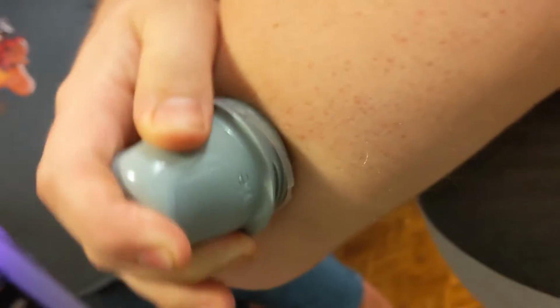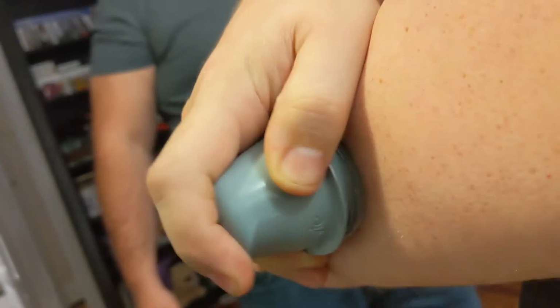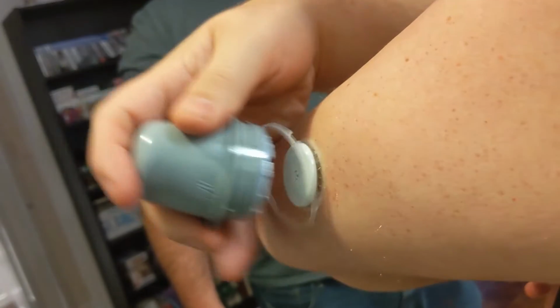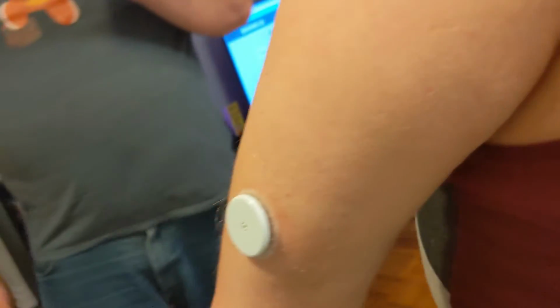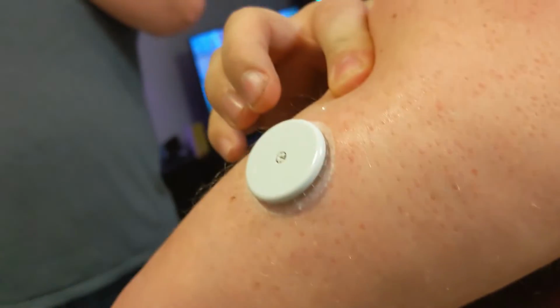Bam! Alexis Mateo. Bam! Now I always do this, push it around a little bit to make sure it sticks in all spots before I take it off. And with any luck, what was that? Something came out. Oh, it just looks like part of the applicator. But, as you can see, it's sticking to my skin.